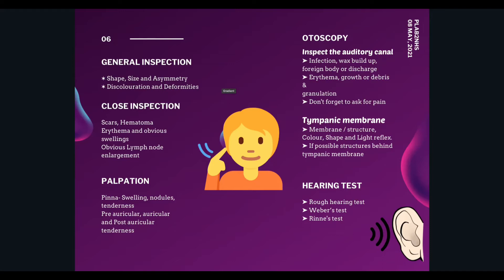Choose the correct speculum size — if you choose too large a size, you may not be able to insert it into the mannequin's ear, which is small and made of rubber material. When you start the otoscopy and insert the otoscope, the first thing to inspect is the external auditory canal. Do not insert completely on the first go — go slowly.